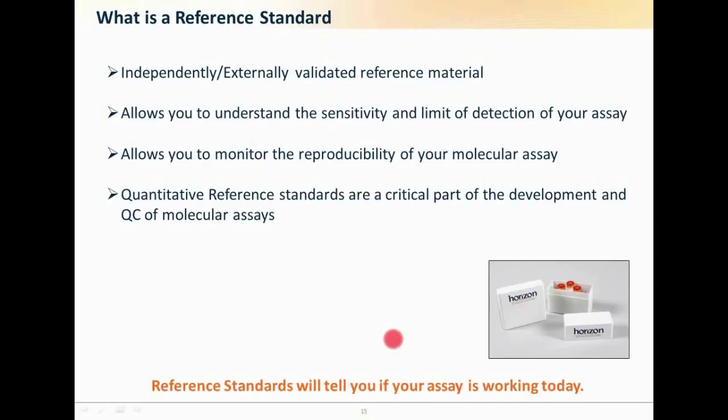With EML4-ALK, some labs may only see 5 to 10 positive results in a given year, and having to use those samples to set up the assay is a big challenge. So if you can set up the assay and get it close to fully optimized and fully validated with reference material, then when you can get your hands on positive material, you can do the final validation with that positive material.